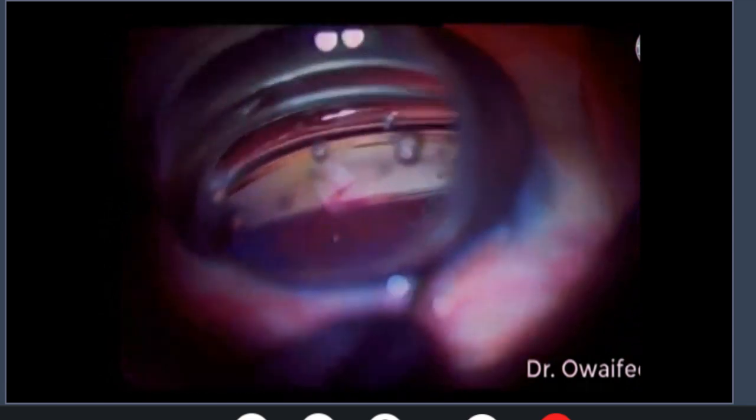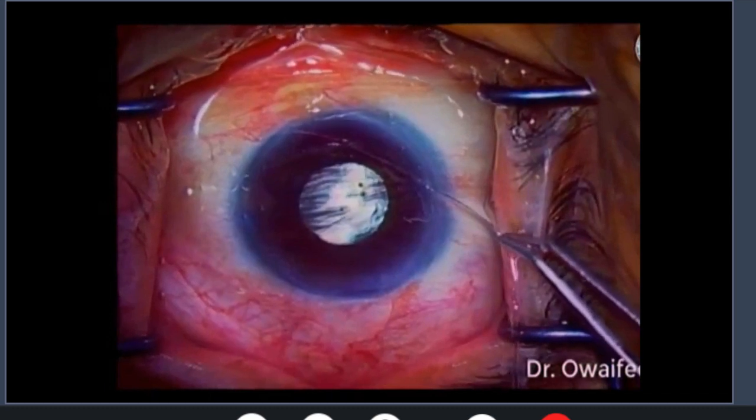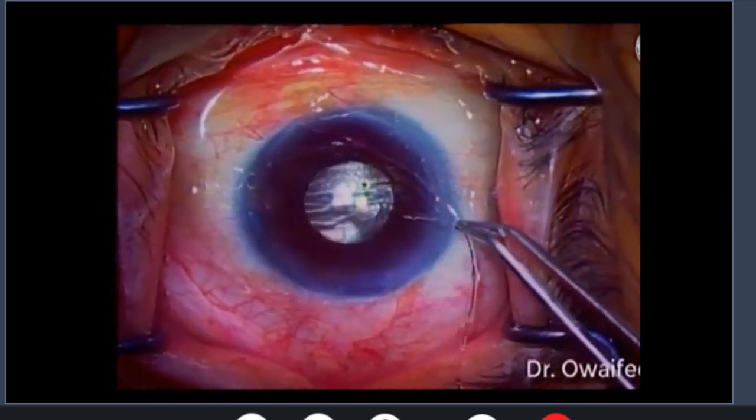inject the viscoelastic. We're creating a small opening to access Schlemm's canal with a 27 gauge needle, and you can see the opening. Then from the inside with the microforceps, you insert the catheter itself, then you advance it through the circumference of Schlemm's canal 360 degrees, and then afterwards you retract it with simultaneous injection of viscoelastic.